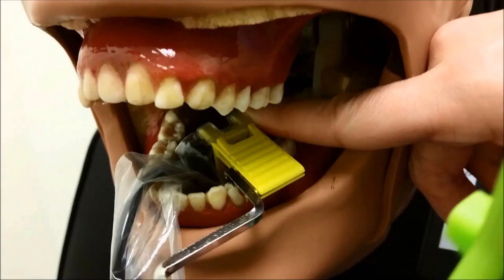Whereas for the posteriors, we are using the yellow ring, and that is the correct position for the posterior. We need to position it as low level as possible in order to view the periapical area of the teeth. Okay, and of course, the line should be also parallel with the long axis of your film.